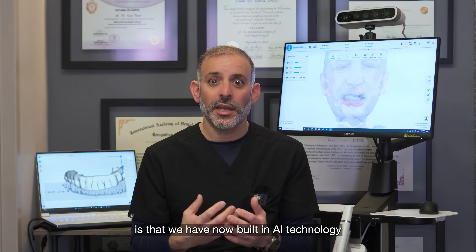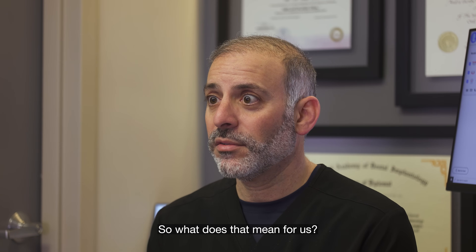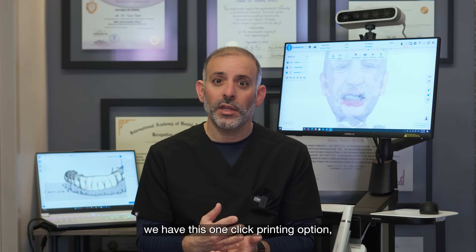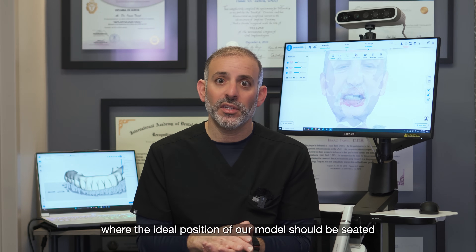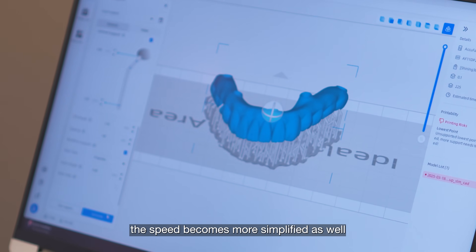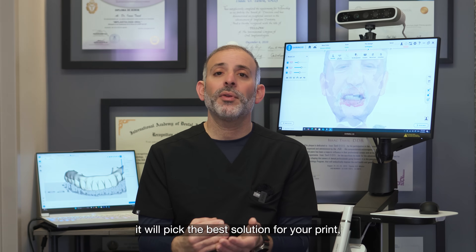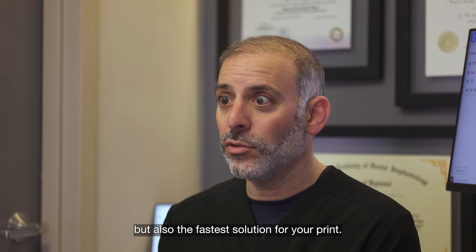We've now built AI technology into both the AccuWear software and into the printer itself. When printing a model, a one-click printing option will automatically generate the ideal position for the model to be seated for the most efficient print possible and also to avoid wasting resin. The AI will pick both the best solution and the fastest solution for your print.